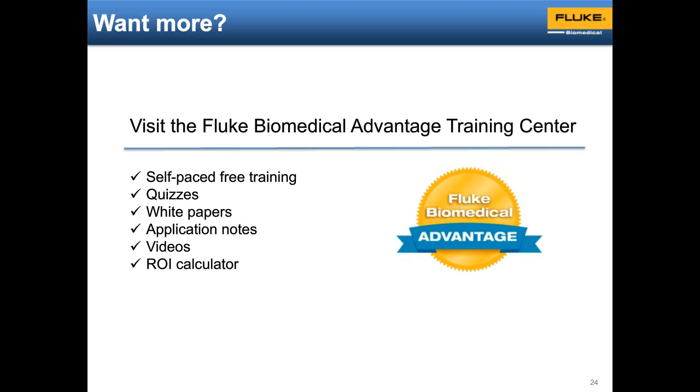Okay, and what equipment do I need to calibrate my SpO2 sensor? So calibration can't be conducted in the field. You'll have to send that back to the manufacturer or discard it if it's a disposable. Okay, and how do I test a reflective SpO2 sensor? So right now there isn't a tester on the market for a reflective SpO2 sensor, but many of us are working on one.